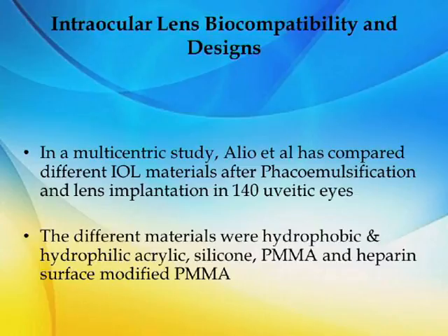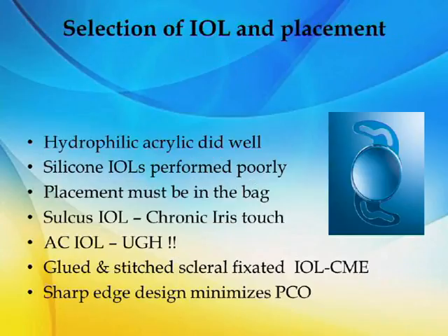The selection of IOLs should also be appropriate. In a multicentric study, Alio et al. compared different IOL materials after phacoemulsification and lens implantation in 140 uveitic eyes. The different materials were hydrophobic and hydrophilic acrylic, silicone, PMMA, and heparin surface modified PMMA. The silicone lenses, in fact, performed poorly.